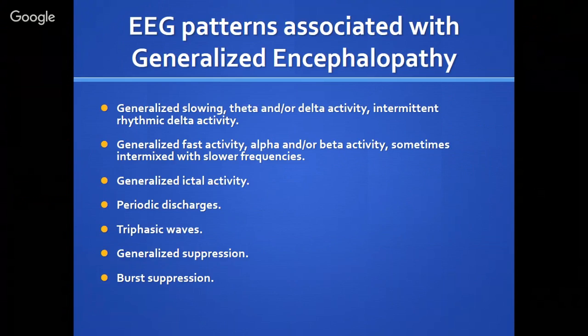But if you place a subdural or electrocorticography, you will be able to pick up higher frequencies up to 500s. All right, and those are the high frequency oscillations, the ripples and the fast ripples, right? Who are now in vogue because, if you have high frequency oscillations on top of underlying spike wave activity, this is most likely the most epileptogenic focus.